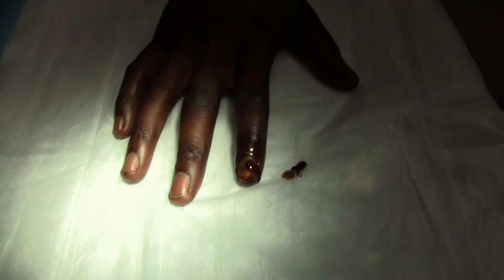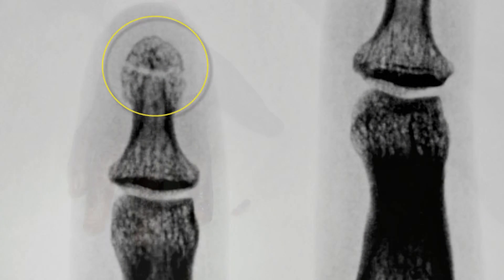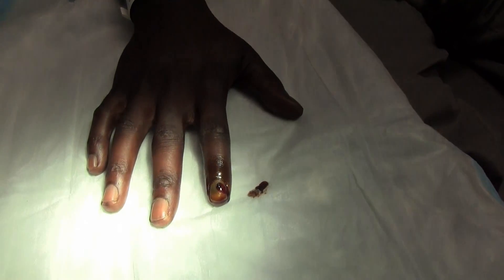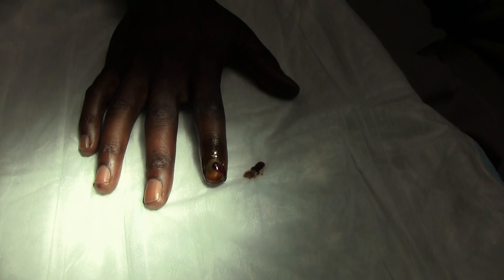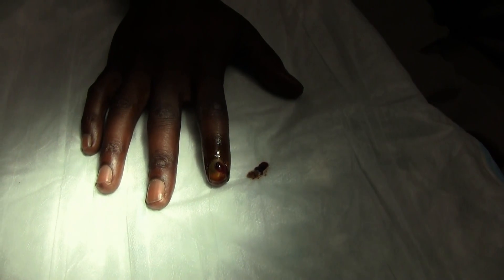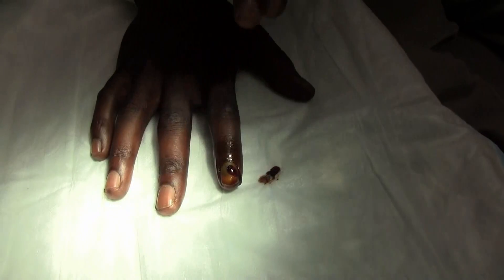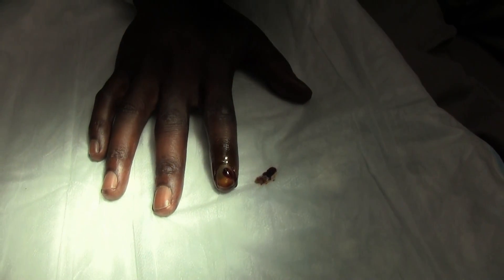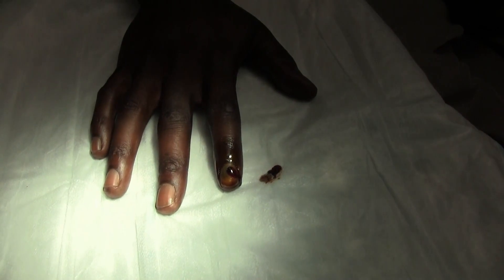So you do have a tuft fracture — the tip of the bone is fractured on that too. We'll send you home on antibiotics and pain medicines. Is it feeling better now that the blood's coming off there? Well, a little bit, but I can still feel that pressure down in the bottom right in there. It's like it's draining down — still feeling it in the bottom of my finger. That's still kind of normal.